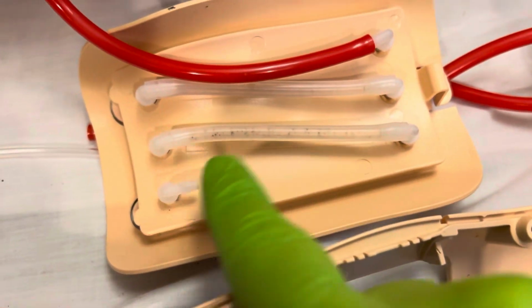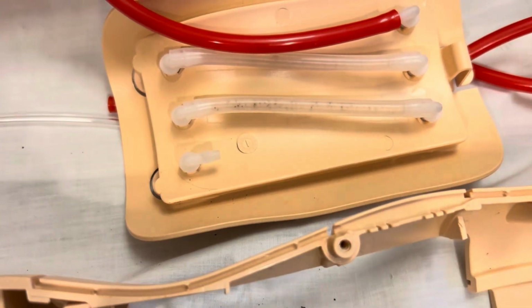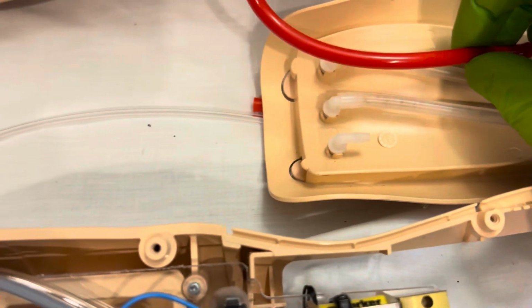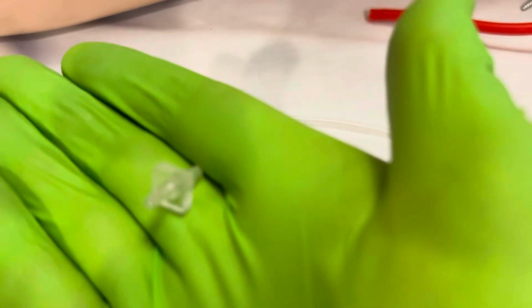Where am I at? There we are. Yes, I know I've got mold in there. I'm going to replace these hoses here after this video, so just bear with me, please. And then the other hose here will go to the adapter that we're going to save, which is right here. And then our new hose, if you don't have this, that's okay. You can reuse the old one. I'm just doing that for a couple different reasons.